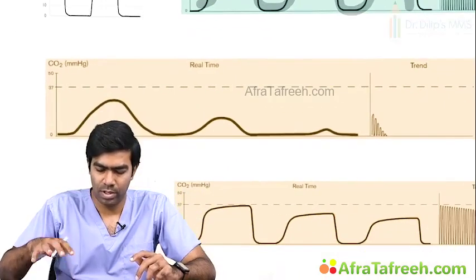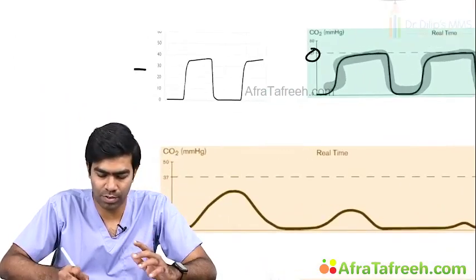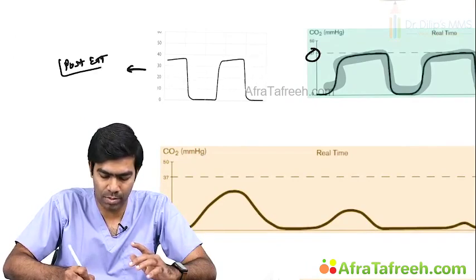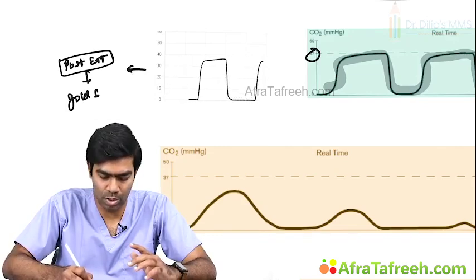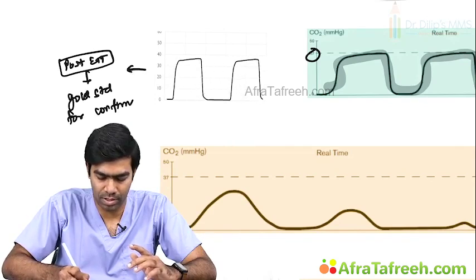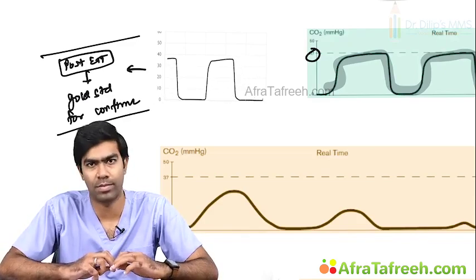Now let us see, if you see this kind of waveform post-endotracheal intubation, it still remains the gold standard for confirming that the tube is in the trachea. I told you this point innumerable times.